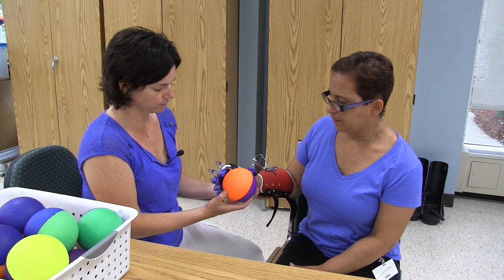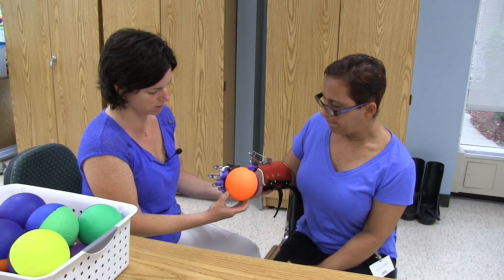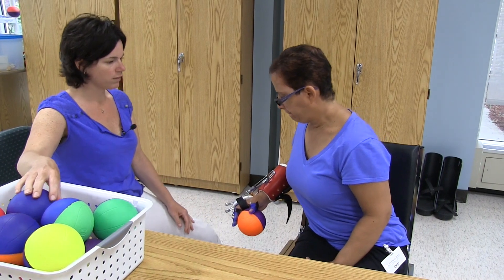You're going to take the ball and squeeze it — squeeze, squeeze. Good. Bring it down, relax, sit up tall.